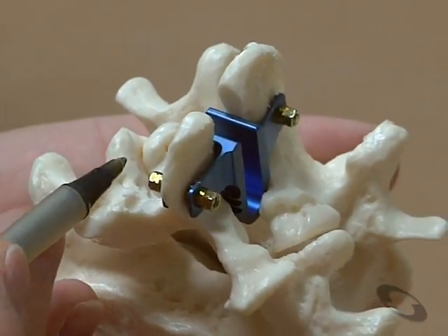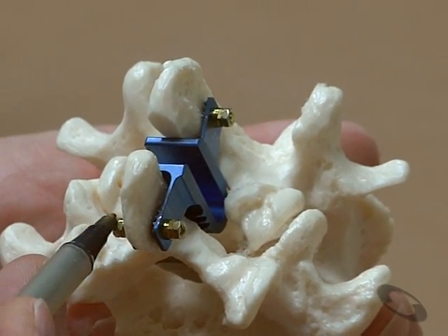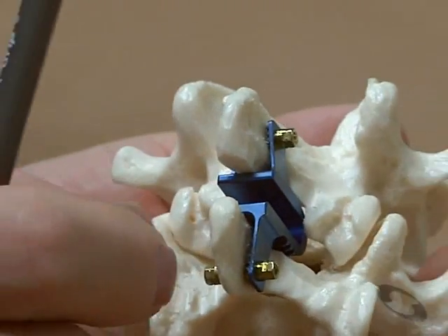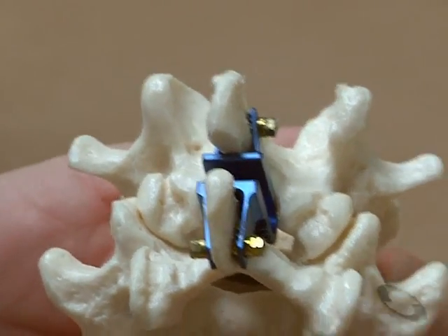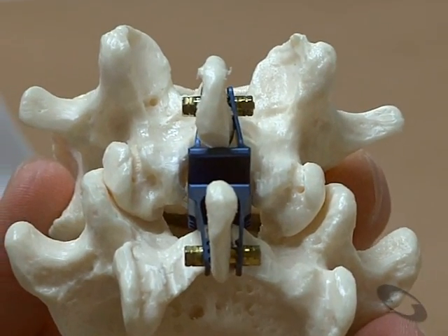And then as a backup and further fixation, these metal screws or rivets will go through the bone and attach to a nut and will be actually screwed down tightly. This is the implant called the coflex-F, which will be utilized in the surgical procedure today.